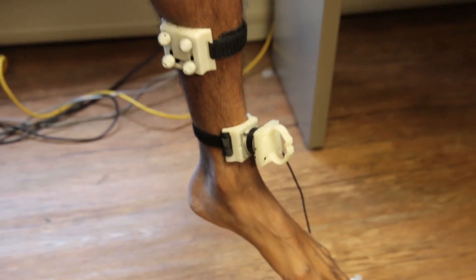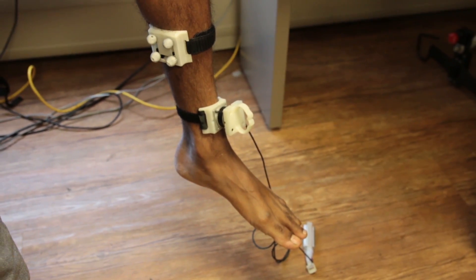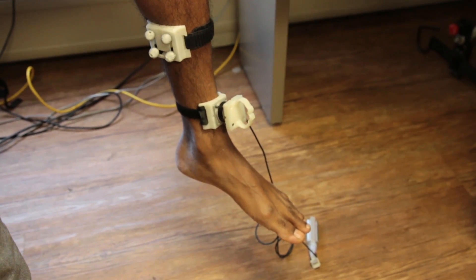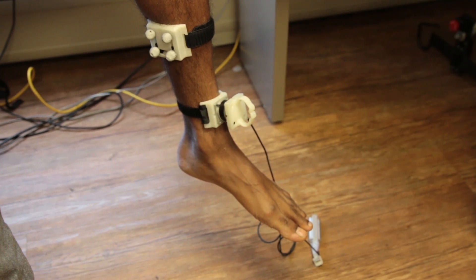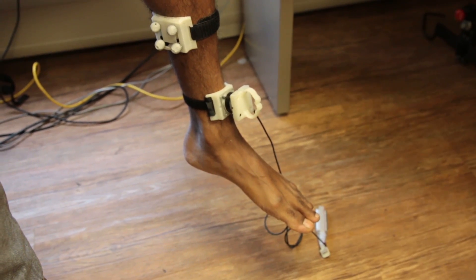For someone with a disability, it should provide us with some estimation of the level of spasticity about the knee joint. This is very useful when we test subjects with disability and provide them with an intervention of some kind.